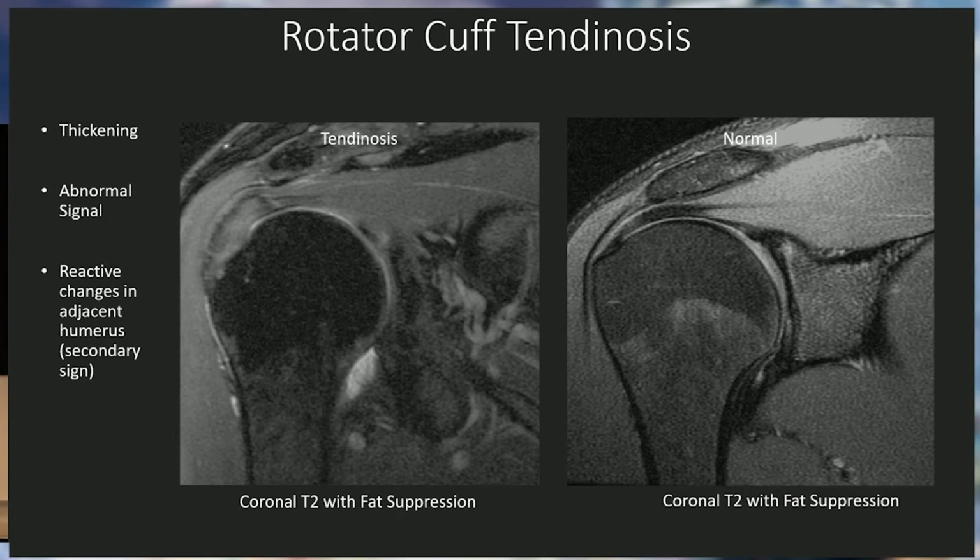I mentioned, in terms of the Three Stooges approach, that earlier there's a saying that having one view is almost as bad as having no view. And that is true for the shoulder. Most people tend to get comfortable with the coronal view when they're looking at rotator cuff pathology, and it's great. Getting comfortable with that really helps confidence. It helps people to evaluate the cuff, but it's limiting.